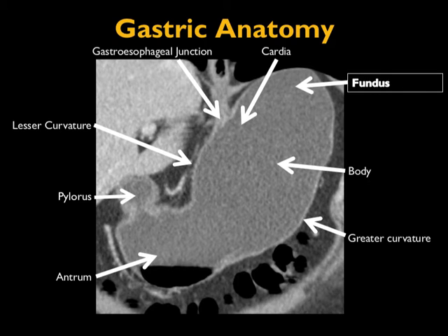Just a couple of comments about anatomy. Classic things we always think about: fundus, body, greater curvature, and lesser curvature. It's always interesting that you have to think for a second what's the greater curvature and what's the lesser curvature when looking at axial imaging. On coronal views it's obviously more apparent, and you can also see the pylorus on those images.